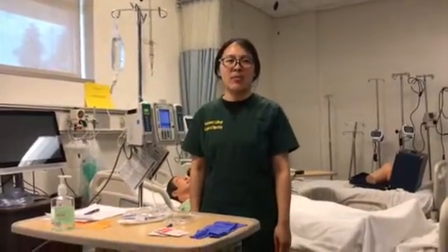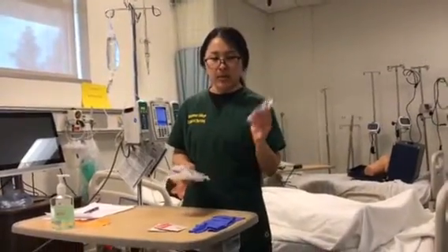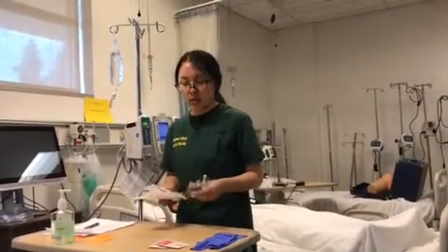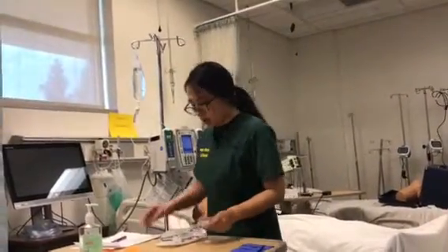Chen. I'm going to handle the IVPB bag for the nursing 130 class. Okay, so I got my medication in the Pyxis. Also, I did my first and second checks in the Pyxis and the preparation room. Now I'm going to do the third medication check at the patient's bedside.